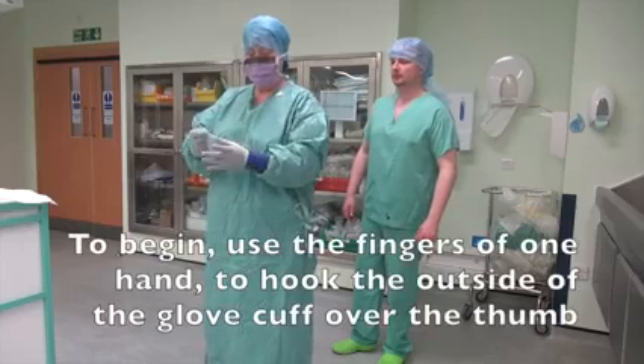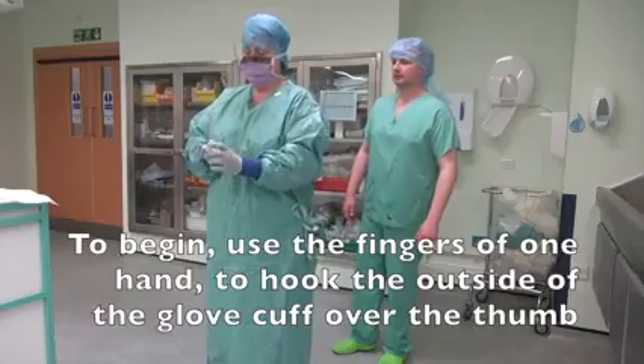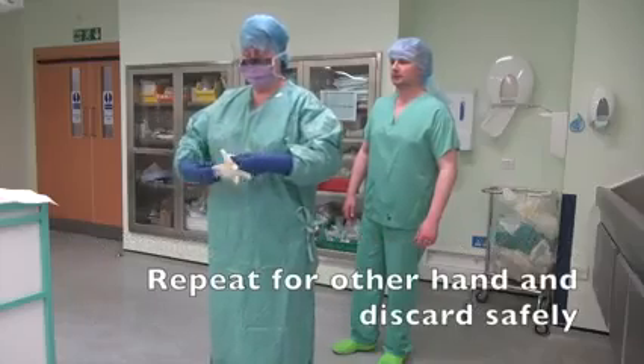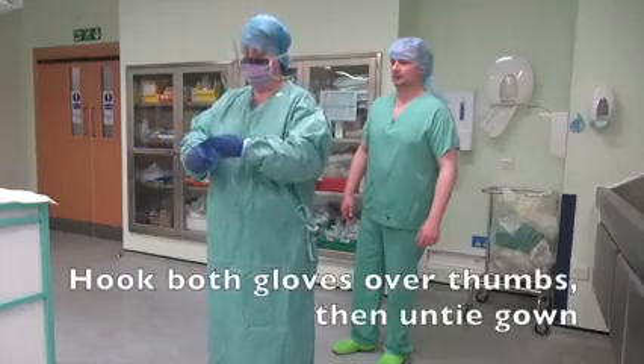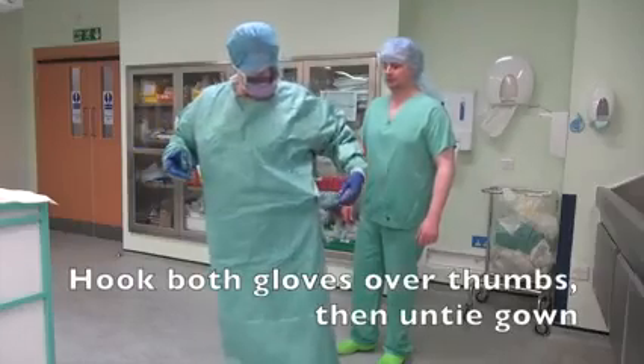Correct procedure for removing gown and gloves. To begin, use the fingers of one hand to hook the outside of the glove cuff over the thumb. Repeat for the other hand and discard safely. Hook both gloves over thumbs, then untie the gown.